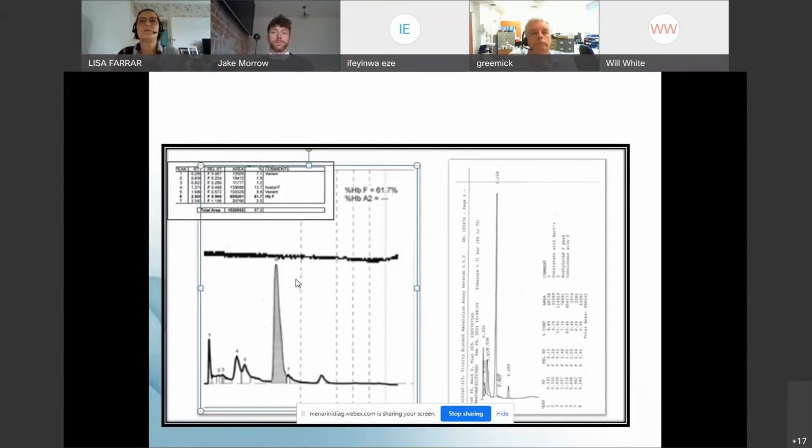So we need to have the ability with any screening or second line screening method to be able to identify very low quantities of hemoglobin A in a patient, because that could determine that they have beta thalassemia intermedia, but also be able to identify hemoglobin A percentages at very low levels, because we have a lot of premature babies in the 20-26 week region.